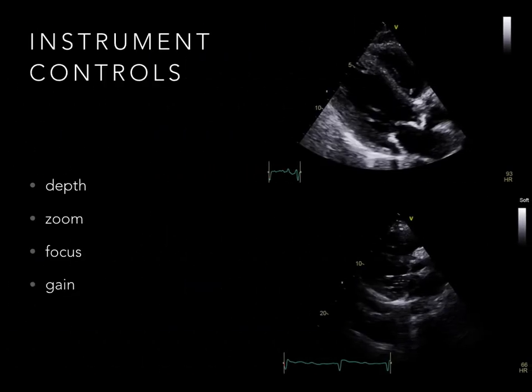By setting the instrument controls to their optimal value, you can optimize your image quality. Don't forget that depth of imaging affects frame rate, and for deeper structures, more time is required for signals to return. This will reduce frame rate. You should aim for the smallest depth that still allows display of the region of interest.